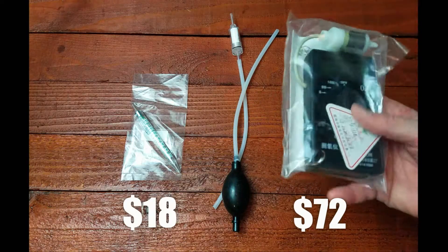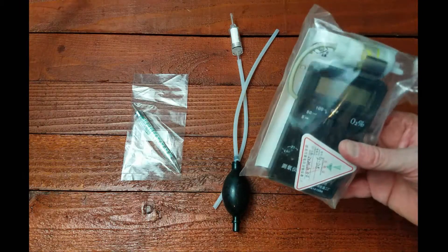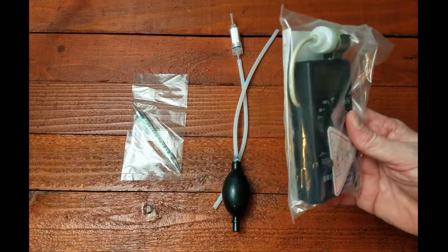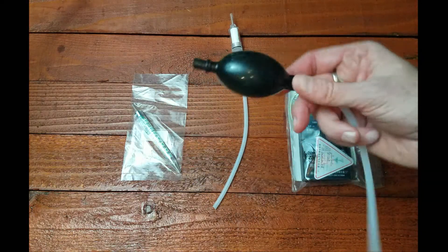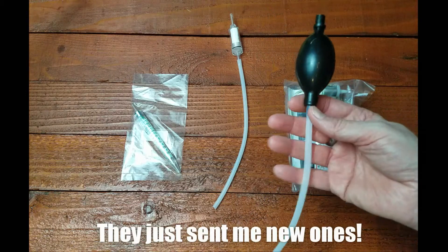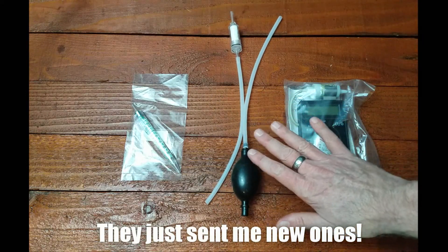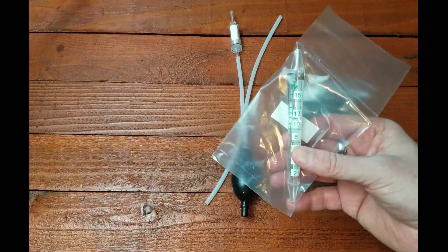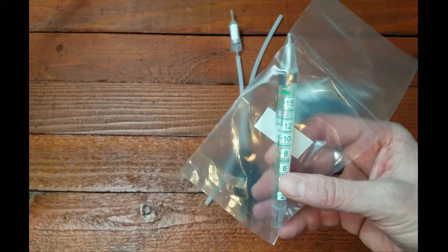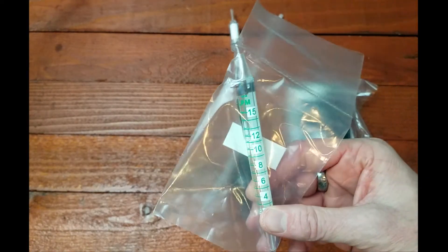This right here is a very popular series all over the web — it's the low end of the reasonably reputable oxygen purity testers. Mine showed up with two parts already used, but they're working with me on that. And here is a flow meter — you see a flow meter on the outside of your concentrator, but it's good to have an external way to test it as well.